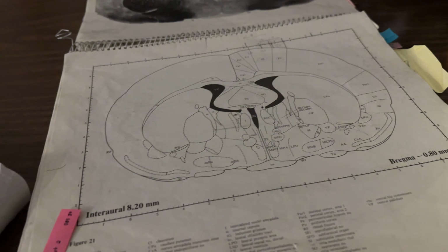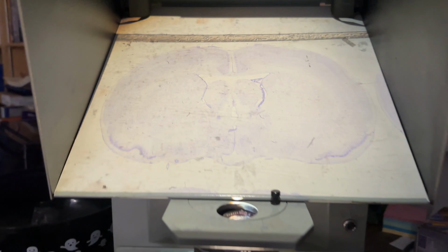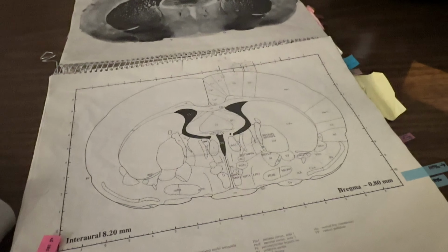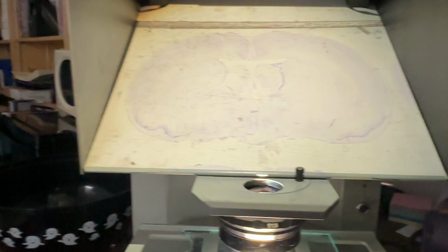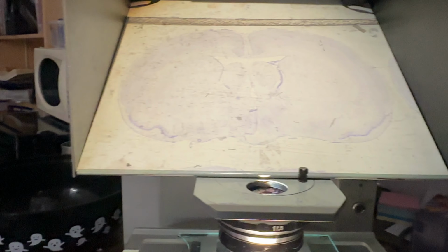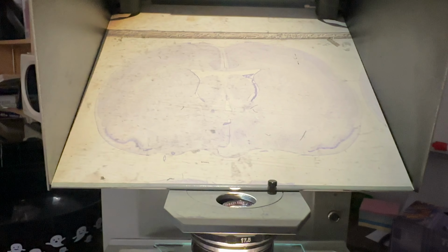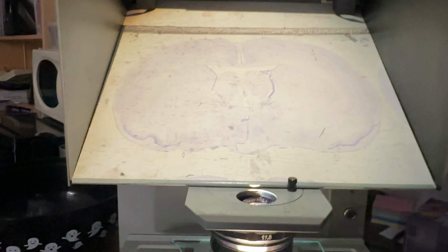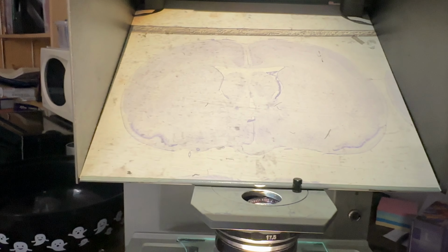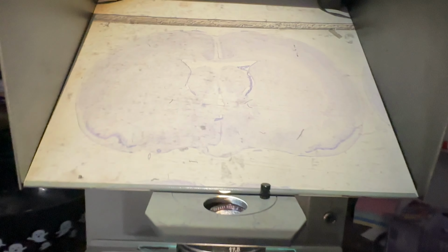In order to do that, we use the rat brain atlas, the RATLAS as I like to call it, and then we use this slide viewer to locate which region of the brain based off of what's on here, to try to tell which slide each region starts on, because each brain is a little bit different, and depending on how we were slicing and which slice we took, because you don't take every single slice. So say if we took every third slice, I believe is what we took, it can be a little different. So we use this to double check what we're looking for.